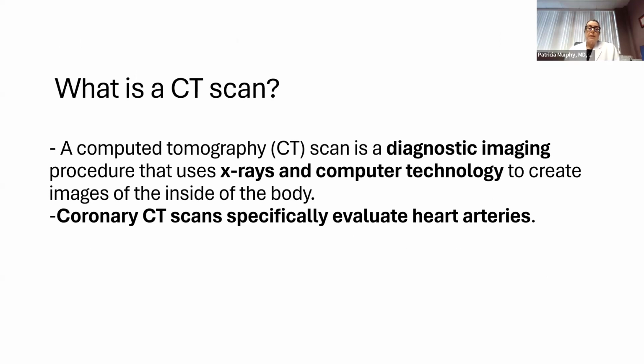But let's back up a second and say, what is a CT scan? CT stands for computed tomography, and it's a diagnostic imaging procedure that uses X-rays and computer technology to create images of the inside of the body. So it's a fancy X-ray that uses a computer to reconstruct the images on the inside of the body. And coronary CT scans specifically evaluate the heart arteries.